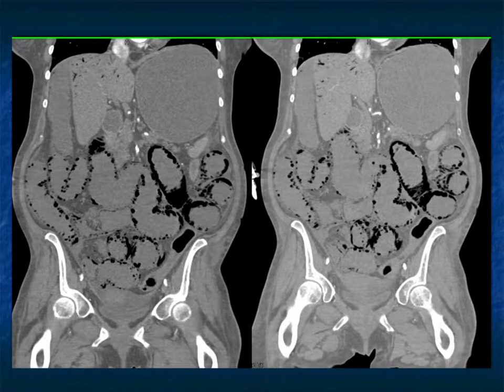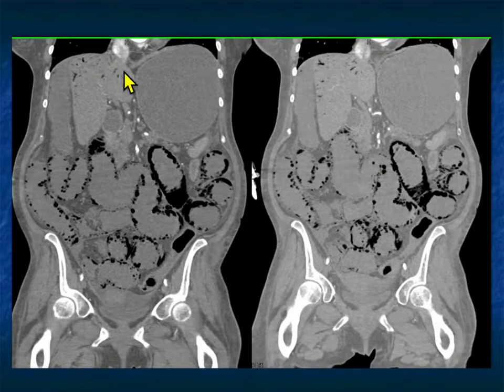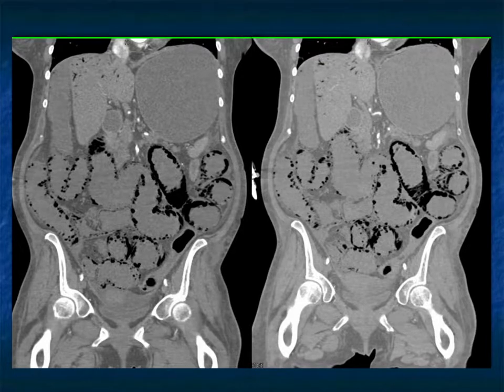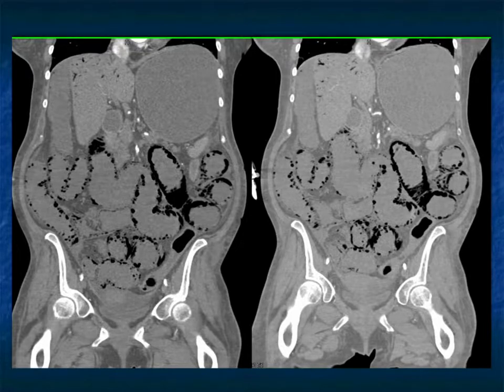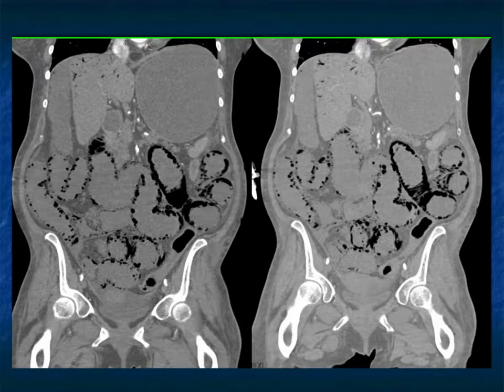Here it is in the coronal view. You also see portal venous air, which is another bad sign. Portal venous air is not necessarily always fatal, but it means you likely have infarcted bowel. Caught early enough, you can still save the patient, but it is a very ominous sign.